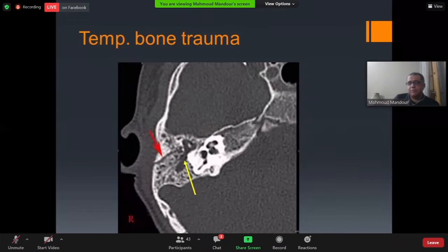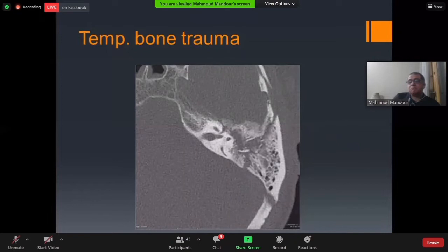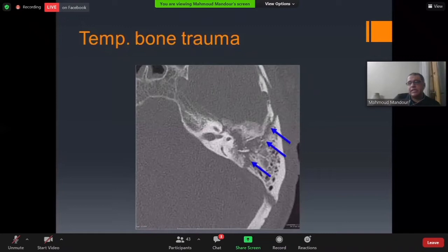In otic bone-disrupting temporal bone fractures, we can identify the round window and basal turn of the cochlea. Sometimes fractures are multiple and comminuted — mixed longitudinal and transverse — as seen here with a transverse fracture line through the petrous part of the temporal bone and disruption of the ossicles.